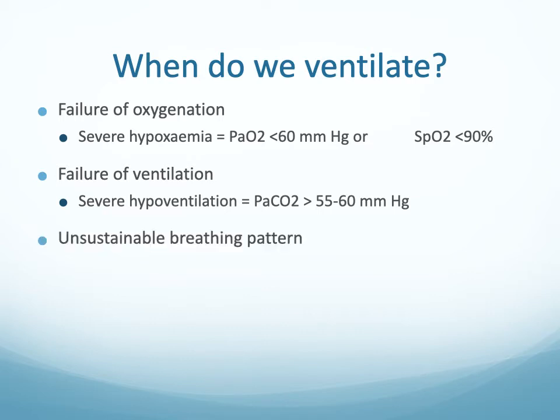The other indication for ventilation would be unsustainable breathing pattern, and I think this one's a really important indication for mechanical ventilation. Now, these patients will have normal blood gases, but their pattern of breathing quickly turns to fatigue.